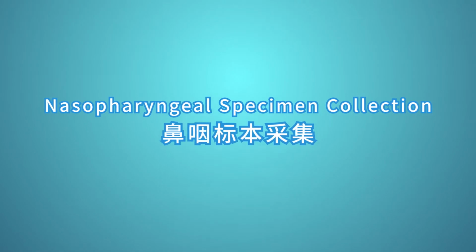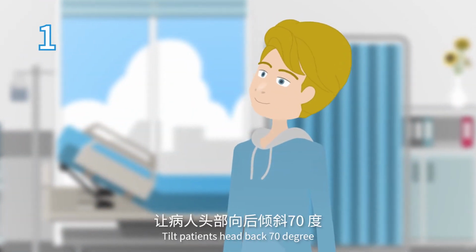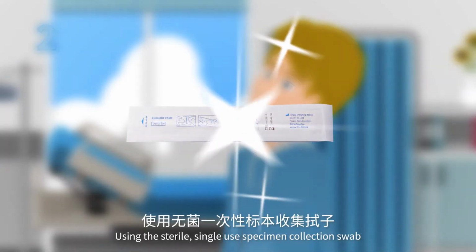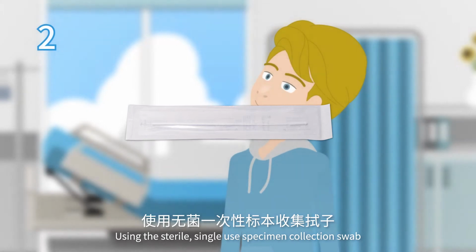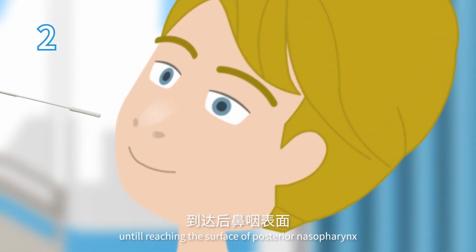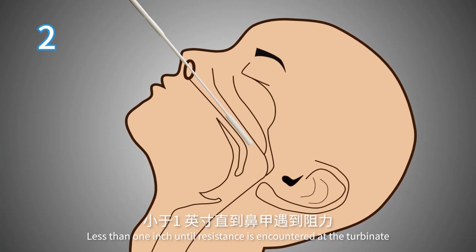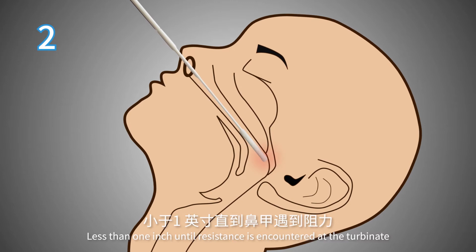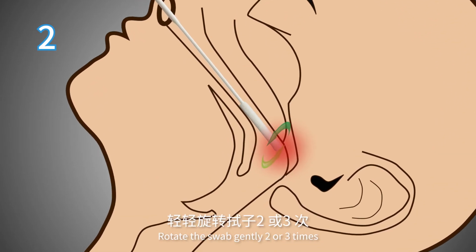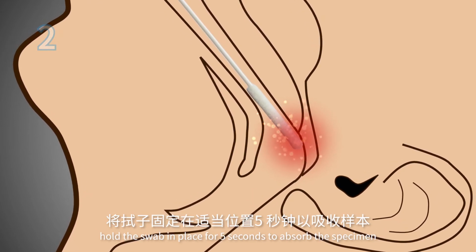Nasopharyngeal specimen collection. Step 1. Tilt patient's head back 70 degrees. Step 2. Using the sterile single-use specimen collection swab, carefully insert it through one nostril of the patient until you reach the surface of the posterior nasopharynx, less than 1 inch, until resistance is encountered at the turbinate. Rotate the swab gently 2 or 3 times. Hold the swab in place for 5 seconds to absorb the specimen.